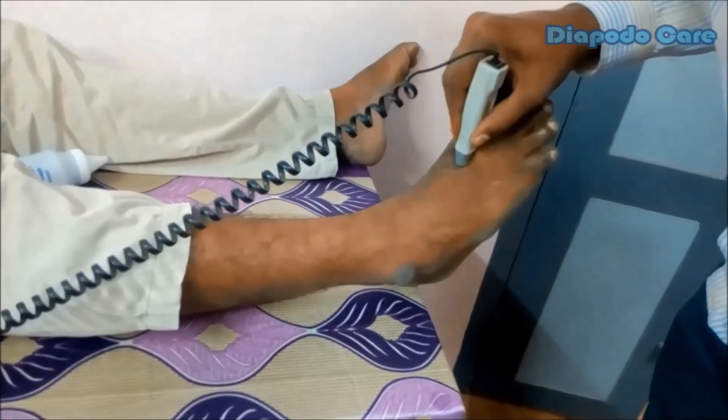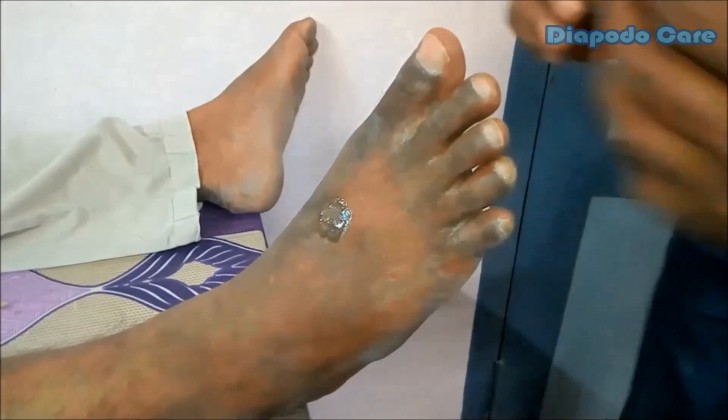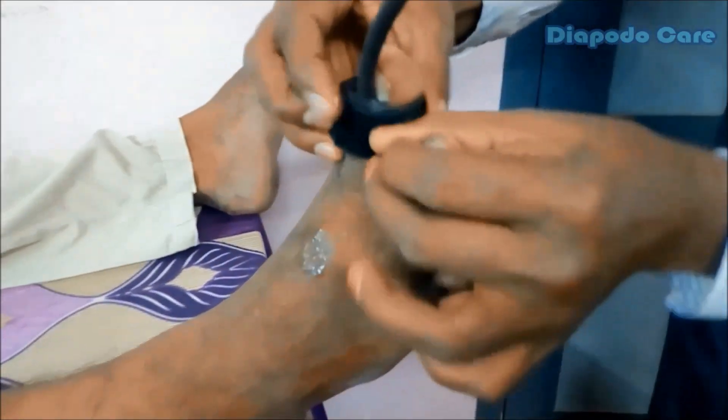After finishing the posterior tibial screening process, perform the screening procedure at the dorsalis pedis position. Finally, toe screening and toe BP measurement must be performed. Unlike Doppler screening, toe screening is performed using the infrared LED toe probe. Toe screening requires visual observation, not sound. The toe cuff must be tied first, before placing the infrared LED toe probe, as shown in the video.